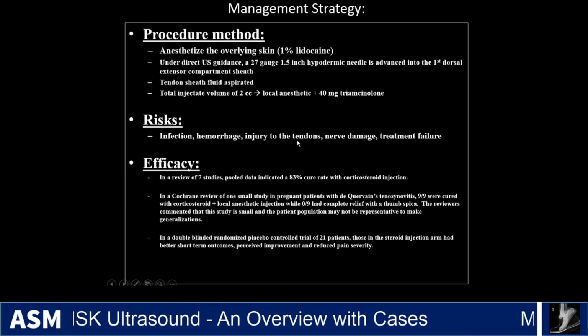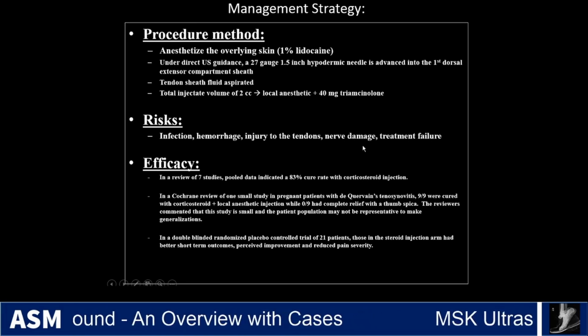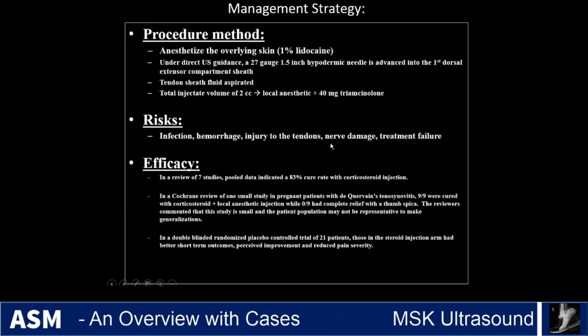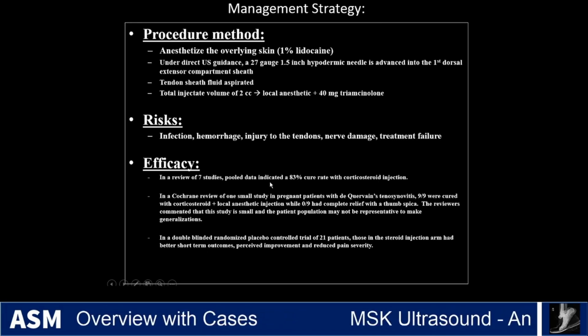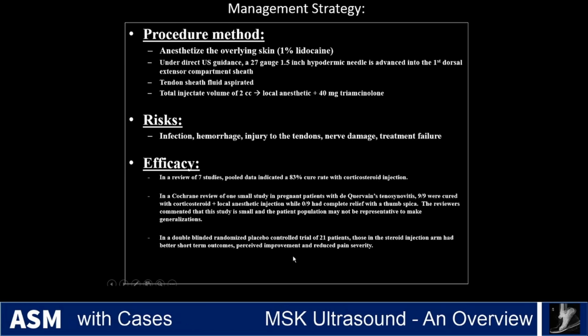Risks associated with the procedure, and in particular with the first extensor compartment, you may be near the superficial branch of the radial nerve, so you want to be careful not to hit that. And then here's a couple of lines about the efficacy of these injections.